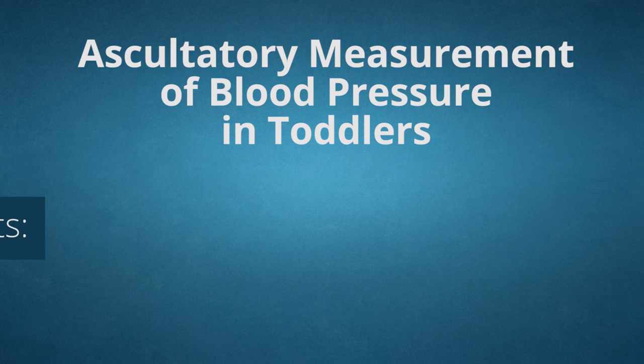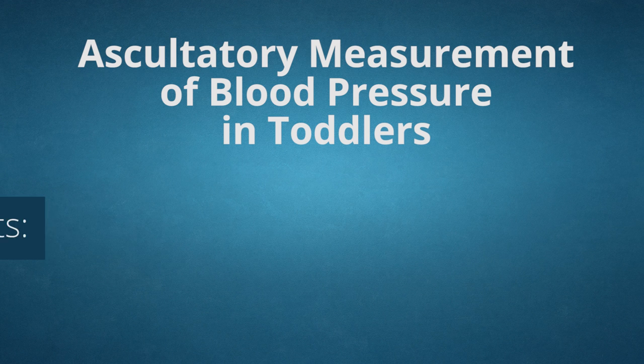There are three key elements to successful blood pressure readings in a toddler: the patient, the equipment, and the technique.